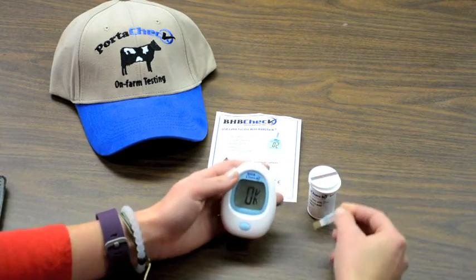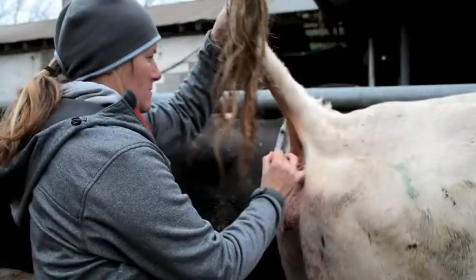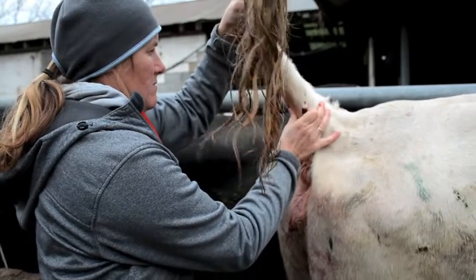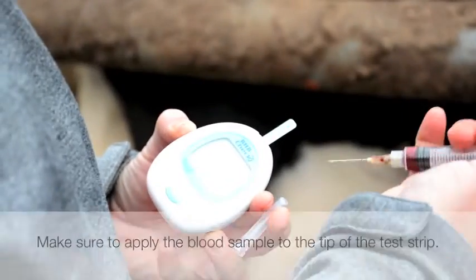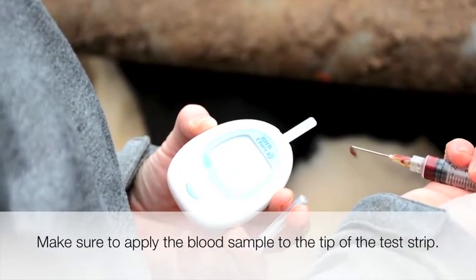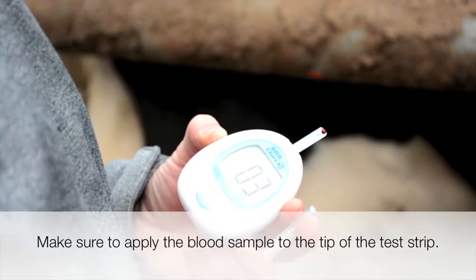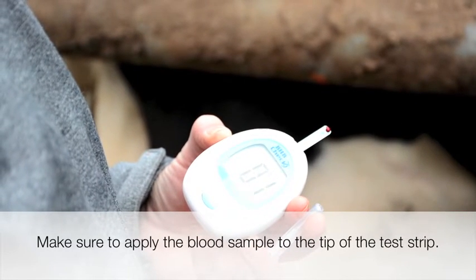We're ready to begin ketone testing on a farm. Draw a blood sample from the cow's tail with a new syringe. Make sure to apply the blood sample to the tip of the test strip. The meter will count down 5 seconds and display a result.